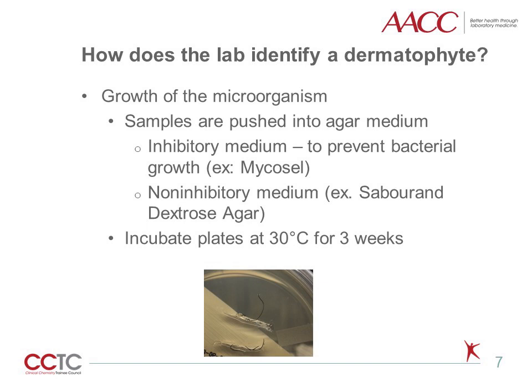A non-inhibitory medium is also used, the most common of which is SDA, or Sabouraud's dextrose agar, as some molds may be sensitive to antimicrobials as well. Embedding the specimen into the agar is best to ensure that the molds come into contact with the media. An incubation temperature of 30 degrees Celsius is used versus 37 degrees Celsius, which is routinely used in other areas of the microbiology lab. This is because dermatophytes grow on the human body and not in it. They also do not handle cooler temperatures well, so specimens should never be placed in the refrigerator. It is typical for most dermatophytes to grow within 3 weeks, so a common practice is to check the plates weekly with the plates being discarded if no mold is present after 3 weeks.